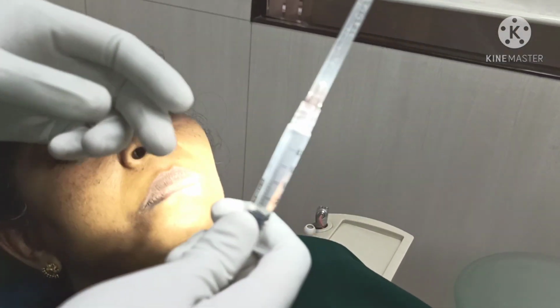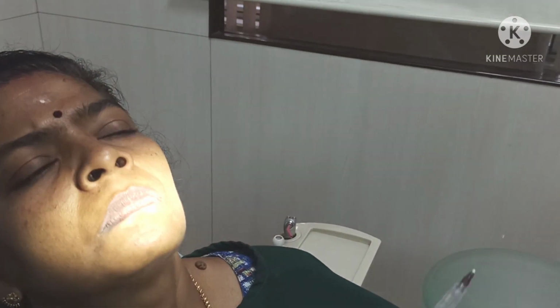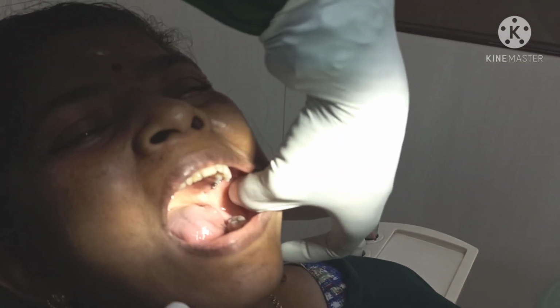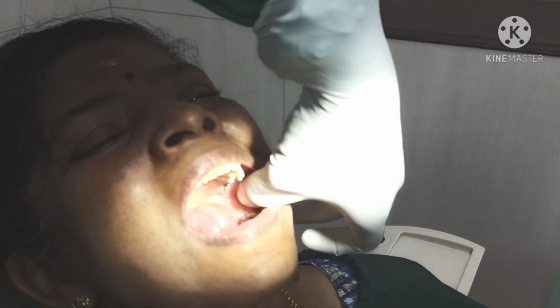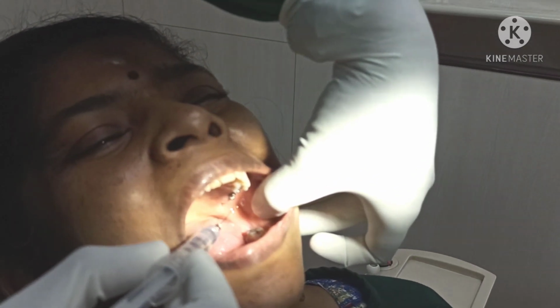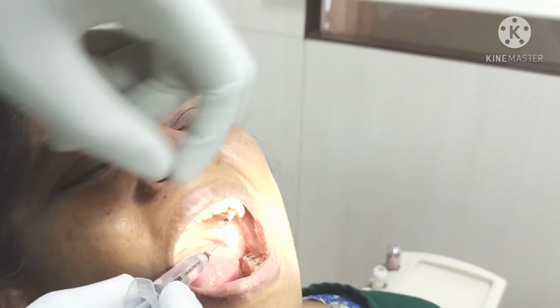Now we are using a regular 2 ml syringe. Make sure there are no air bubbles. If you are planning to use a cartridge, that is fine. If you are planning to use computerized anesthesia called STA, that is also fine. Now we are going to give the block. Keep the thumb here. As I already told, even if you are not palpating, that is fine. This is the pterygomandibular raphe. This is approximately 8 to 10 mm above the occlusion plane.